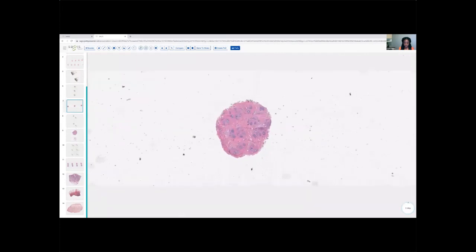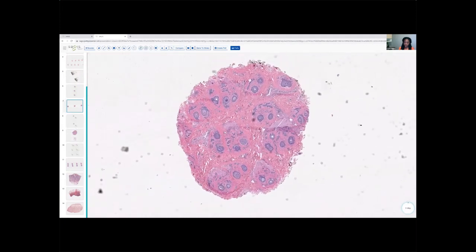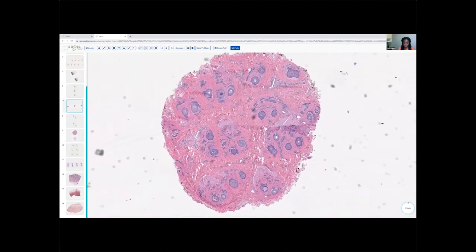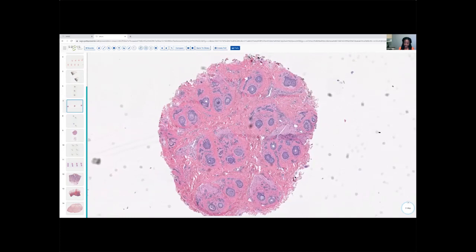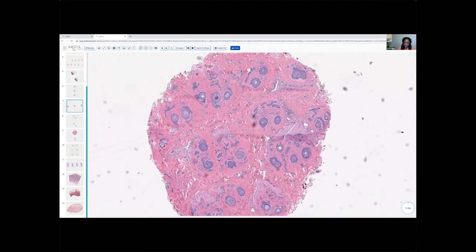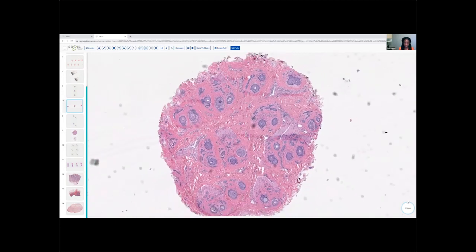Contrast to this condition. So again, we're looking in transverse section, a horizontal section, and always we want to first of all decide what level of the skin we are looking at. We don't have a lot of help in this example, but we have some. We just have to find it. Okay, and we do see that we have our pilosebaceous glands there. There they are. So we have pilosebaceous glands. We know, therefore, that we must be in the isthmic zone, right?